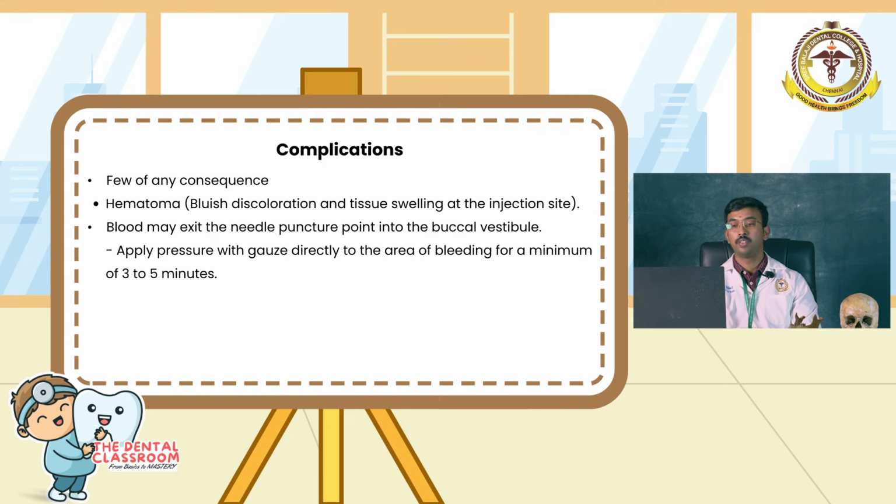Complications are very few and very rare. You might develop a hematoma, which can appear as bluish discoloration and tissue swelling at the site of injection. Blood may exit the needle puncture point into the buccal vestibule, and if it occurs, apply pressure locally for 3 to 5 minutes.